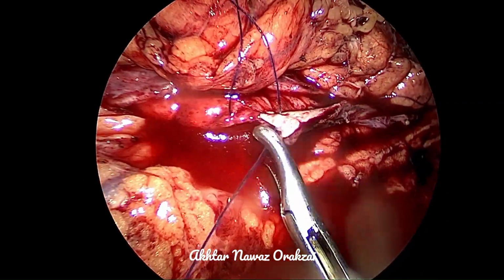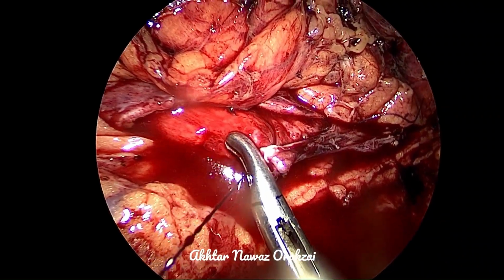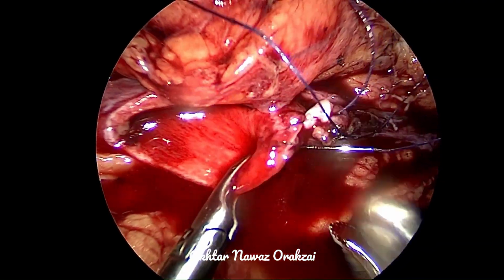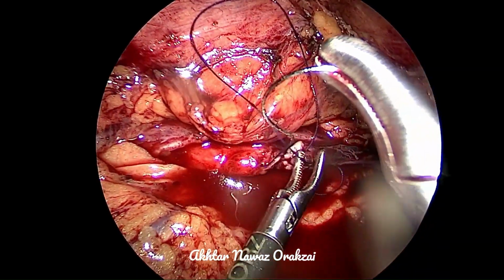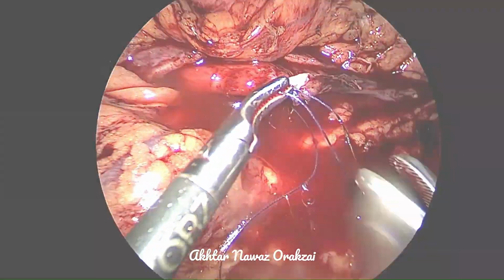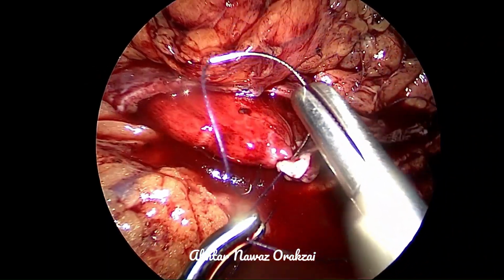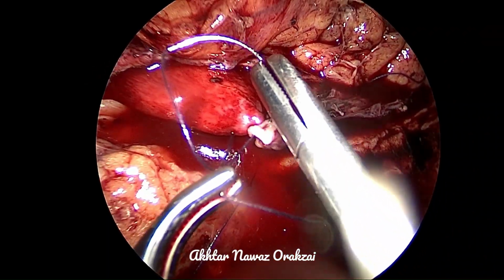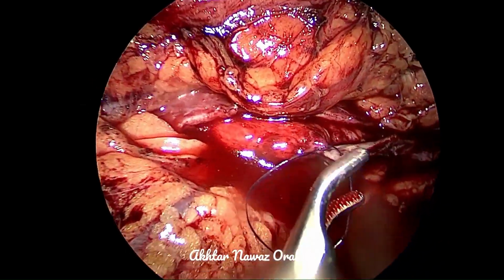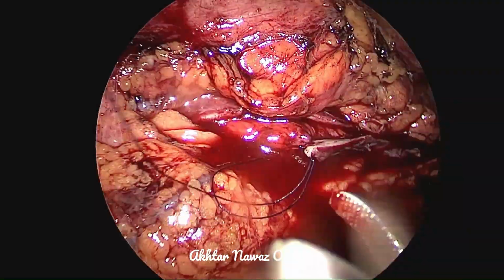Okay, reaching at the tip, this is an important step here. We have brought the suture outside the anastomosis, and now we are going to create a loop, and that loop will be outside the anastomosis, and hence we will be doing the completion of anastomosis of this side by knotting the loop. You can knot the loop, you can interlock the loop.